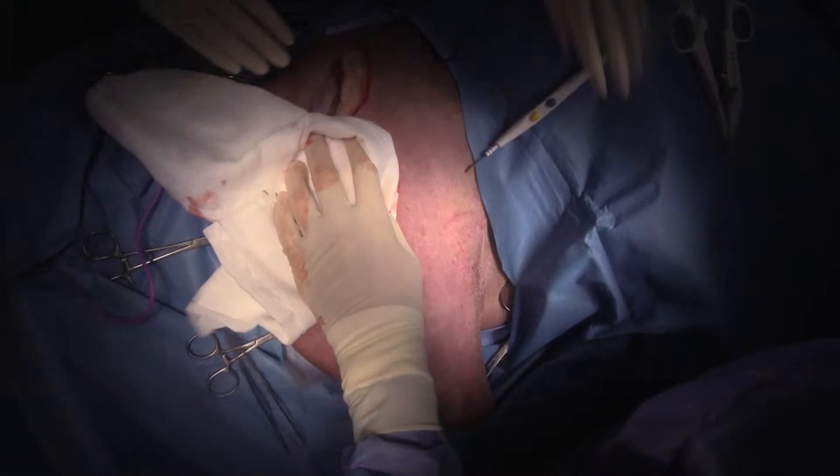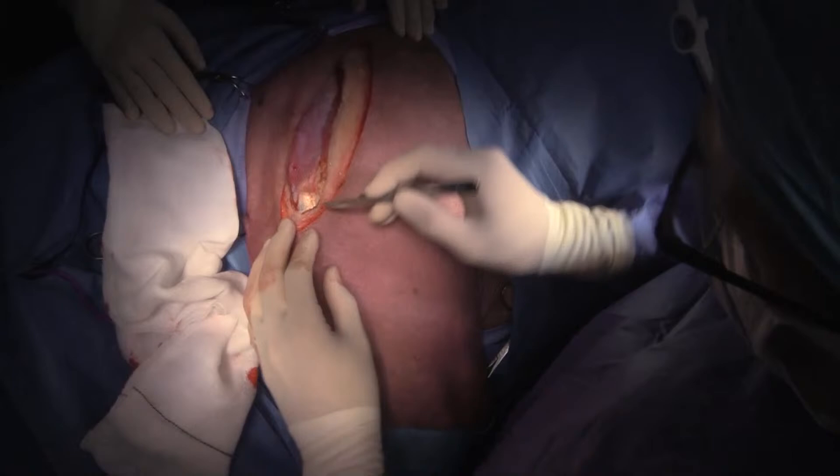Other complications of limb salvage surgery include recurrence of the tumor, infection, and biomechanical failure of the repair. So now I'm coming around caudally here.